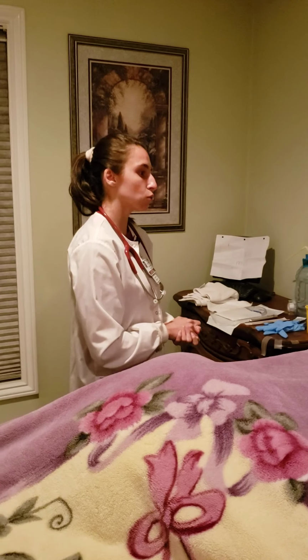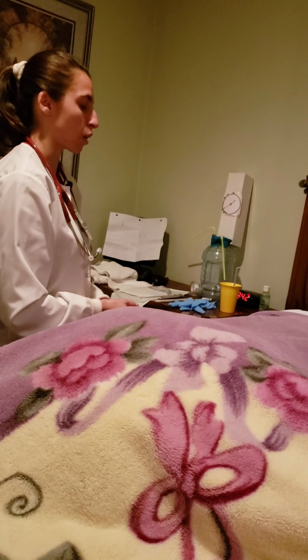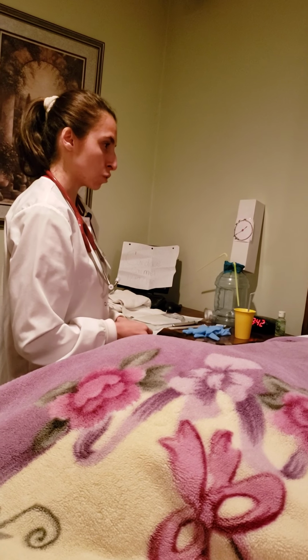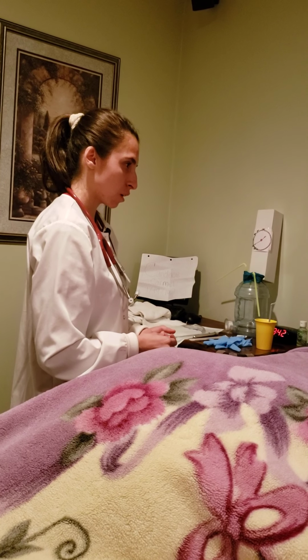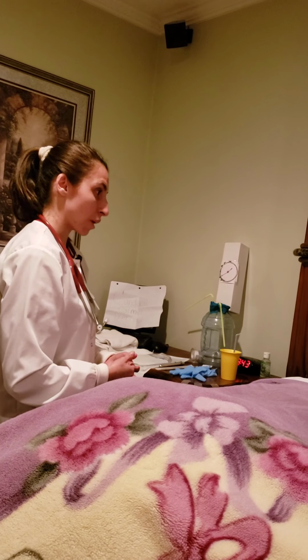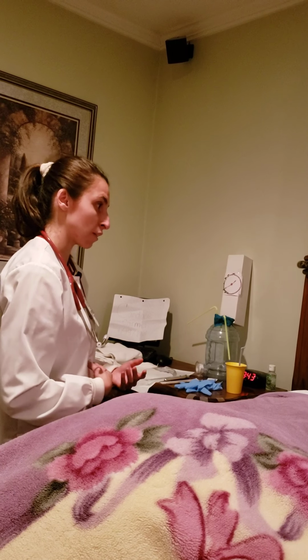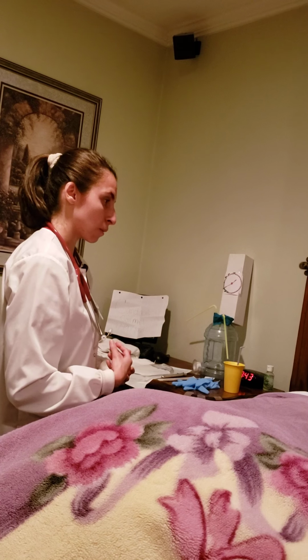So, Miss Carmel, how are you doing today? You're doing just okay? What seems to be the problem? Having some nausea, vomiting, and you start noticing your stomach starting to bloat? Okay. I'm so sorry to hear that. Well, Miss Carmel, that's actually why I'm here today. I had just talked to your physician about the symptoms you've been feeling, so your nausea, your vomiting, and the bloating in your stomach. We like to call that abdominal distension.